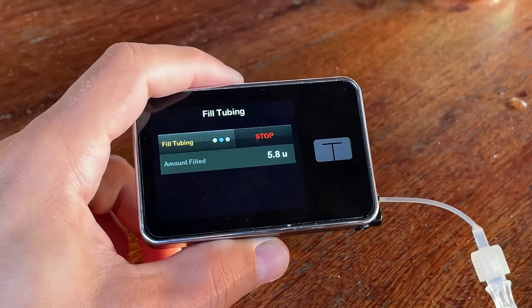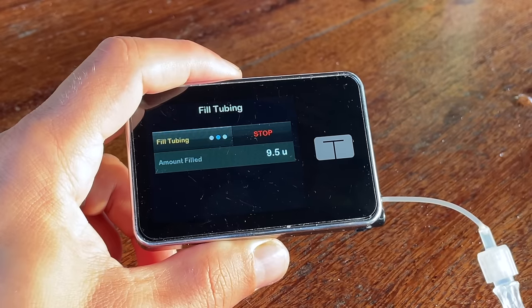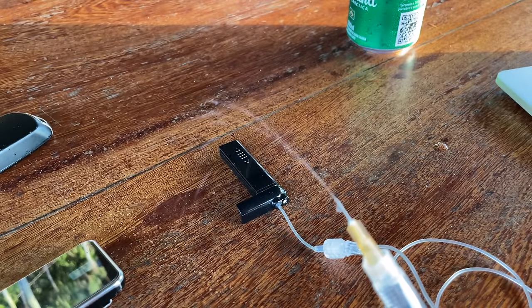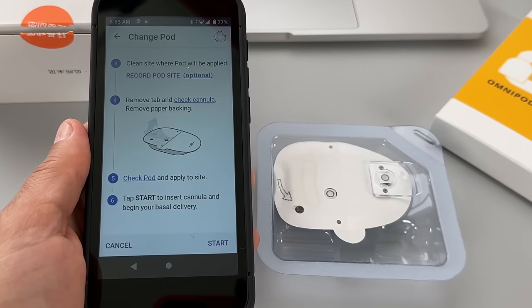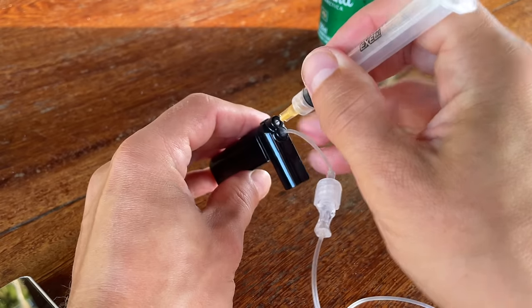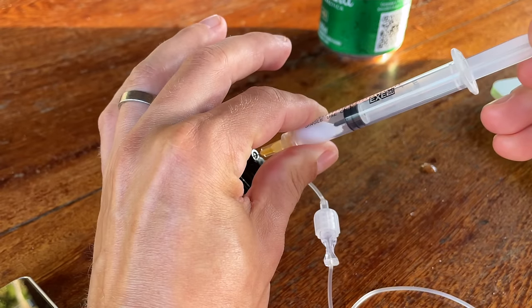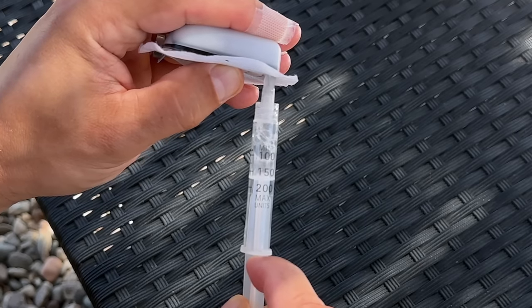Another thing to consider is insulin waste. The Omnipod 5 is tubeless so insulin waste during priming is less than the T-Slim, where there's always some unused insulin left in the tubing when you dispose of an old infusion set. On the other hand, Omnipod has a hard stop every 80 hours, so you might end up with quite a bit of unused insulin in the pod that gets wasted. T-Slim doesn't have a hard stop so you can delay the cartridge change a bit longer to use most of the insulin. In an emergency you can pull unused insulin from either pump's cartridge, but keep in mind insulin goes bad at some point — do this at your own risk.